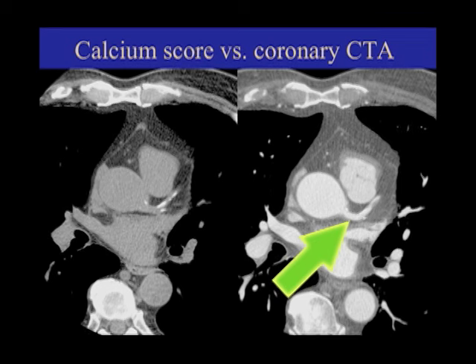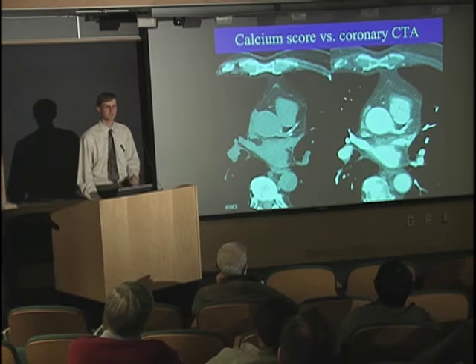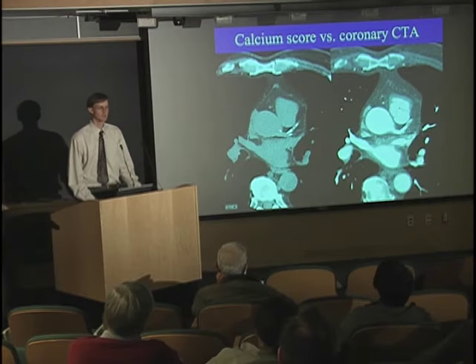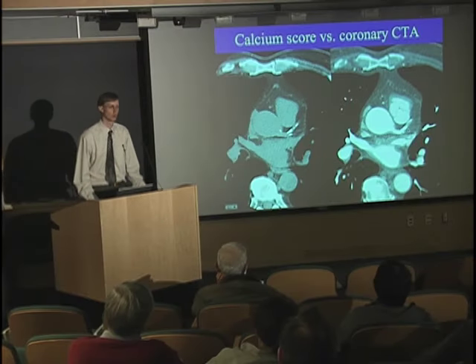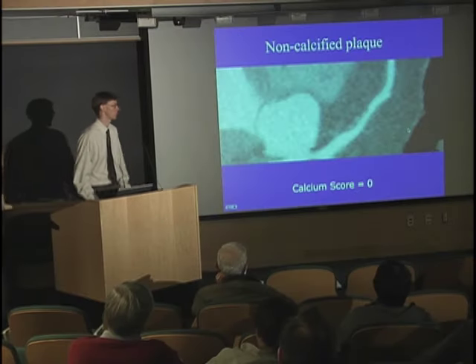With the contrast CT, I can say this vessel looks open. And so despite there being calcium here, I don't really see a narrowing. So if this patient had chest pain, I'd say it's probably not from their coronary artery disease.